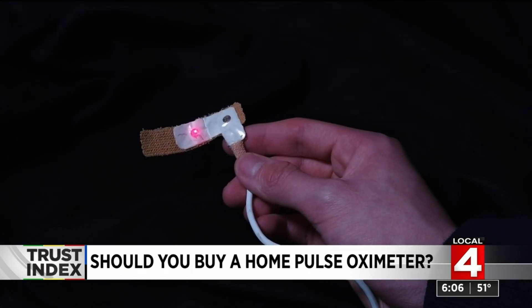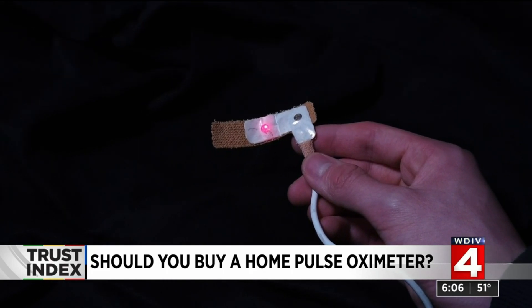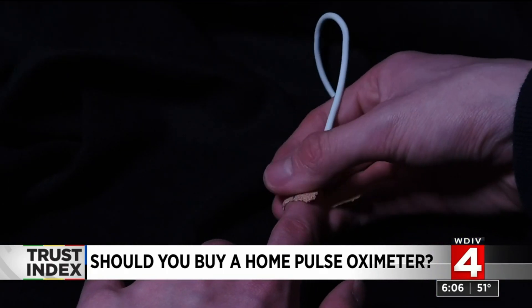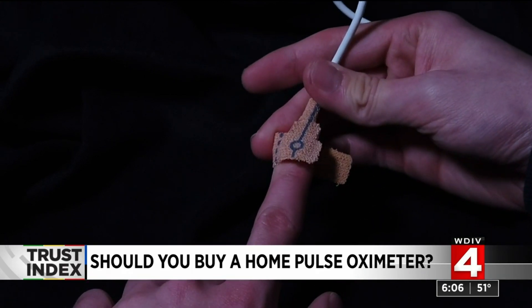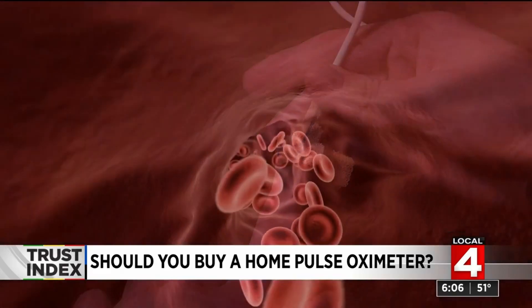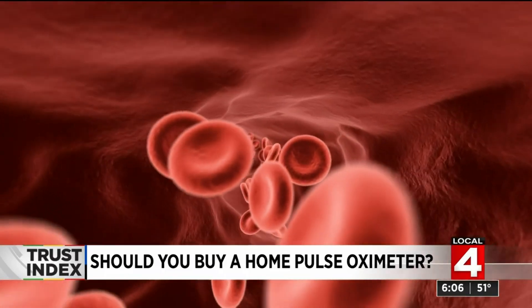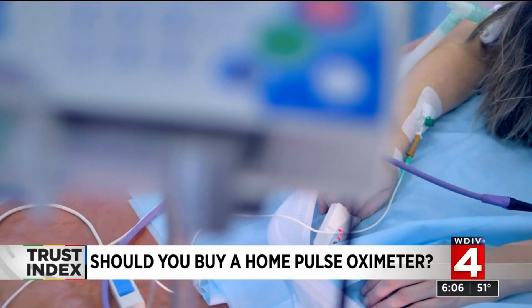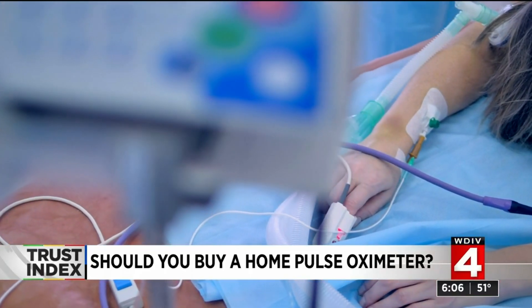In the hospital, many people are put on a monitor called a pulse oximeter. It works by painlessly shining a special red light through the pad of your finger or even your earlobe and detecting how much light can be seen from the other side. The light is absorbed differently depending on how much oxygen is being carried by the hemoglobin in your blood. The monitor gives you a number — that's the percentage of hemoglobin with oxygen.